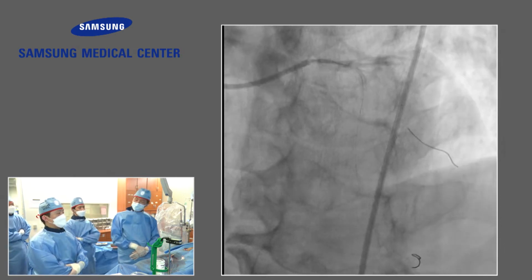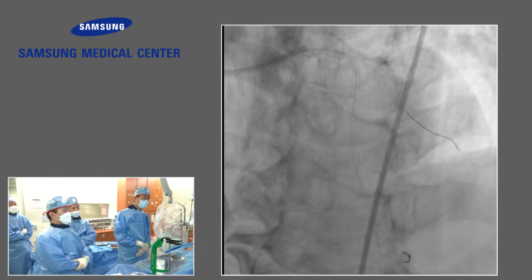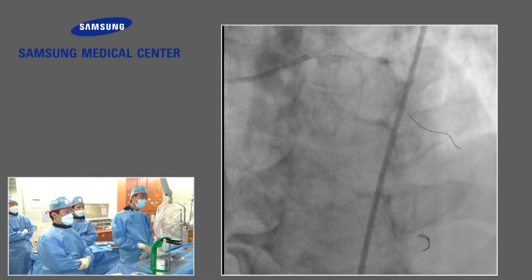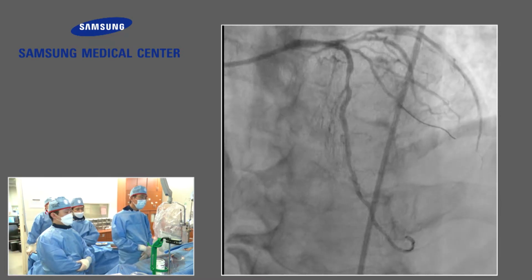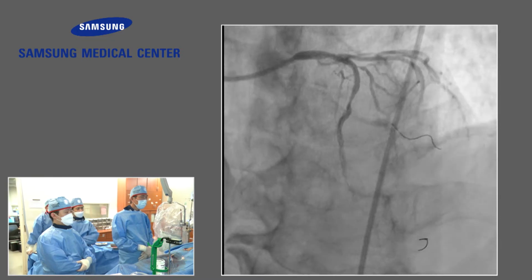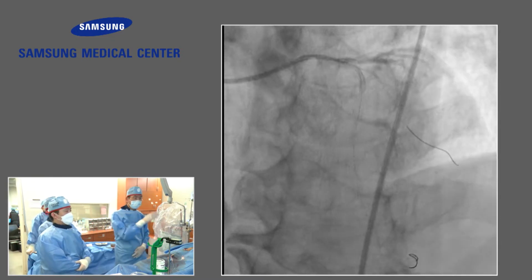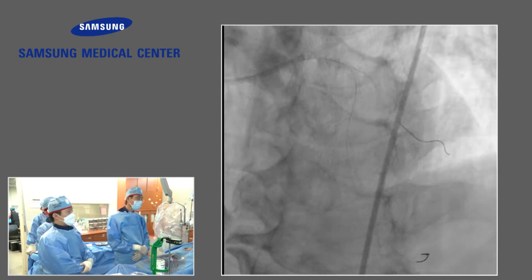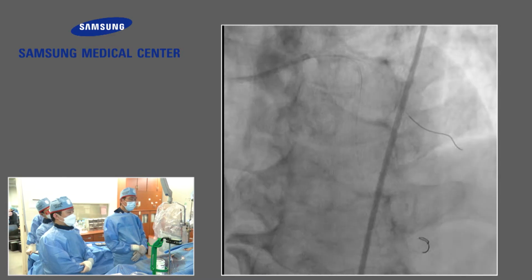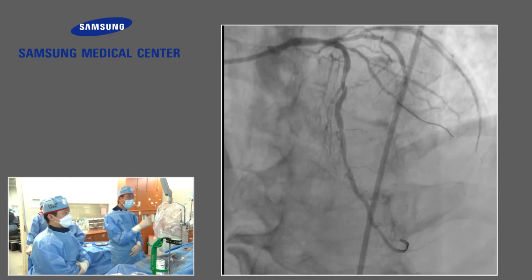So a little bit more compromise of the diagonal ostium. Do you want to do a kissing ballooning for this lesion? Yeah, most physicians prefer final kissing balloon to open the diagonal ostium. Actually, the first side branch ballooning didn't improve much. The flow is okay, so I decided to leave it alone. Okay, next.